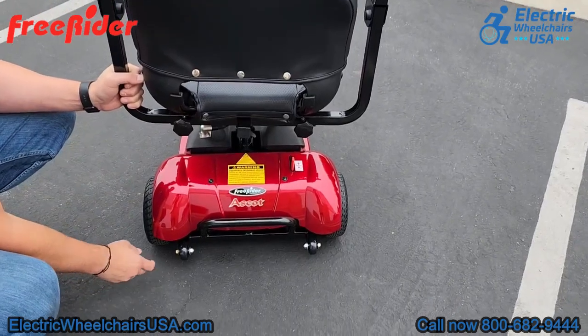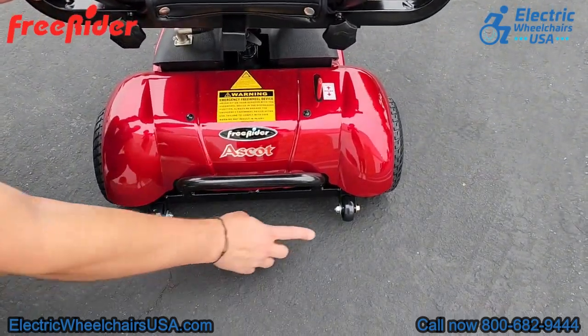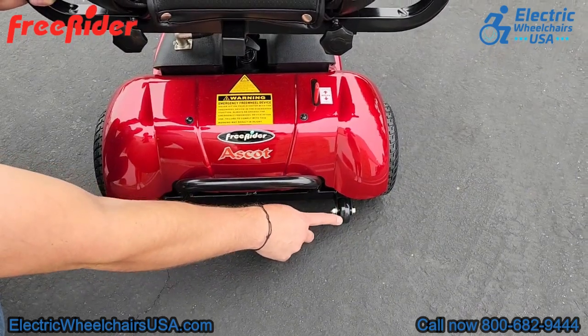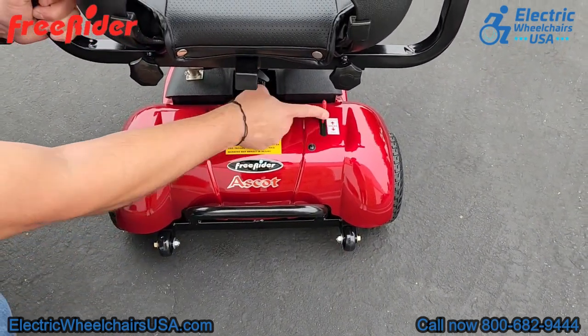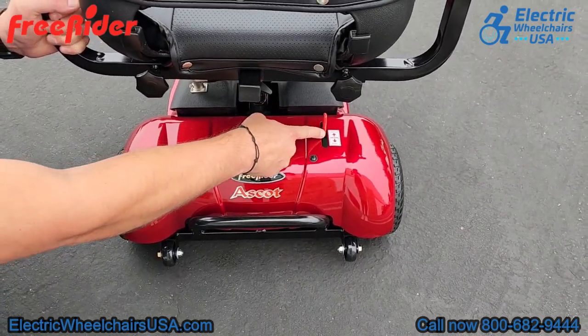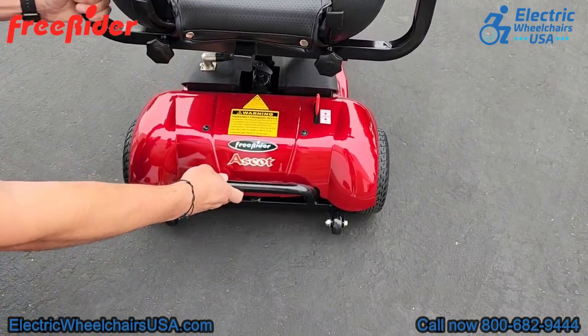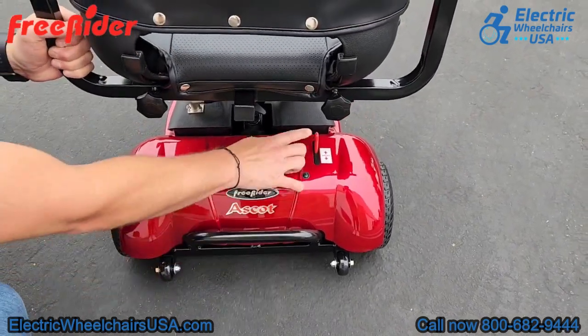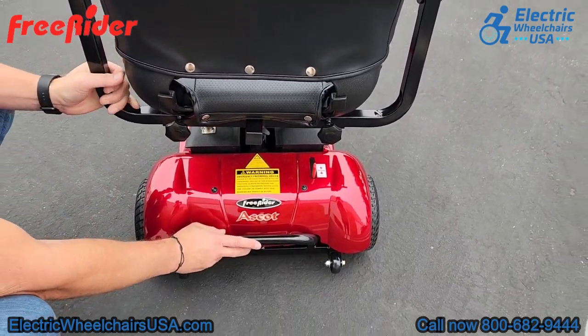These are your rear anti-tip wheels, here for added safety — if you were to go up a steep incline it prevents you from tipping backwards. This is the freewheel lever: if you run out of battery life you can press the lever forward and push the scooter to your destination to charge it. However, you cannot operate the scooter in freewheel mode; you need to push the lever back into the drive position.